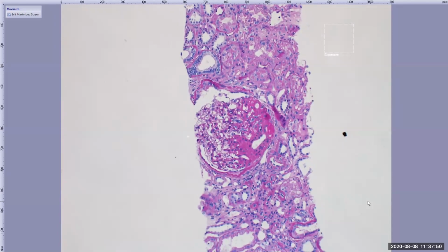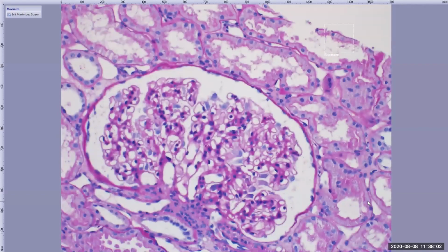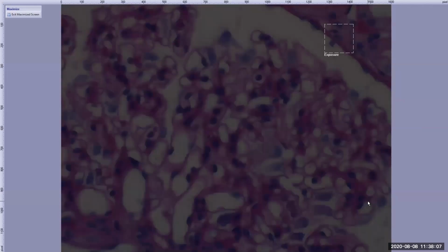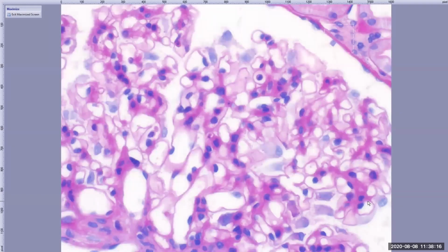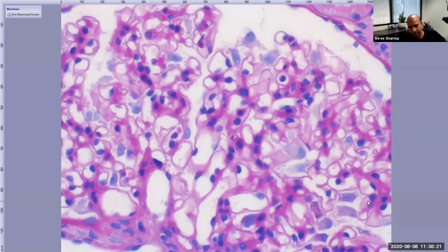On the microscope, you need to fill at least 50% of the field at 40x. On the software, it varies by application, but normally it has to fill the screen. That's where the discrepancy is. Here it is filling up the entire field, and I am at 40x on my microscope.